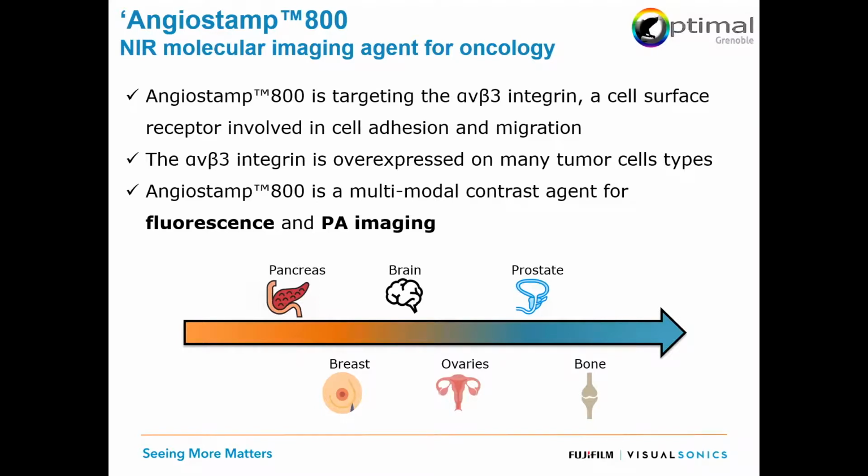So if you want to then image the entire mouse, for example, imaging penetrating light from one end, light scatters, and you will not always reach a centimeter.